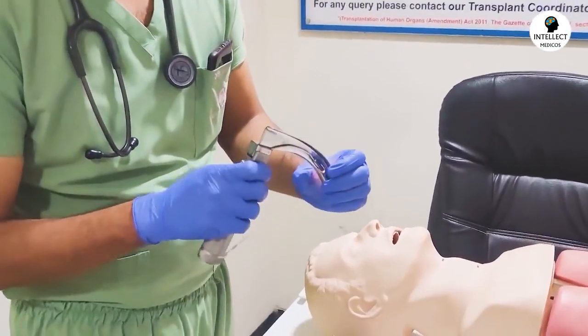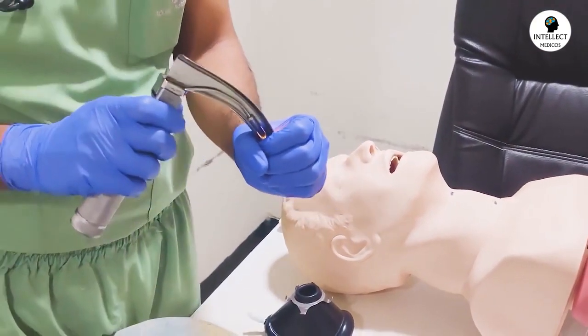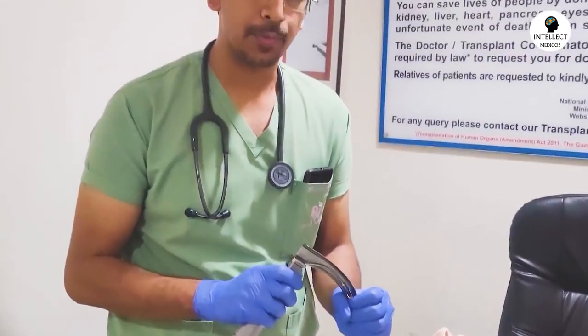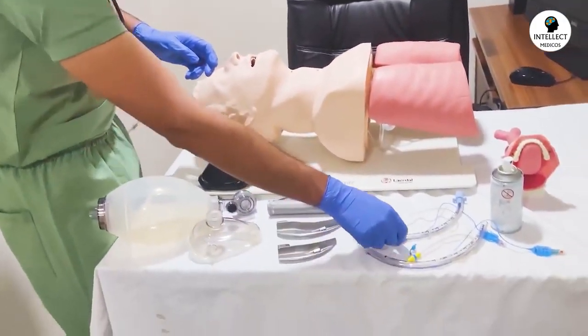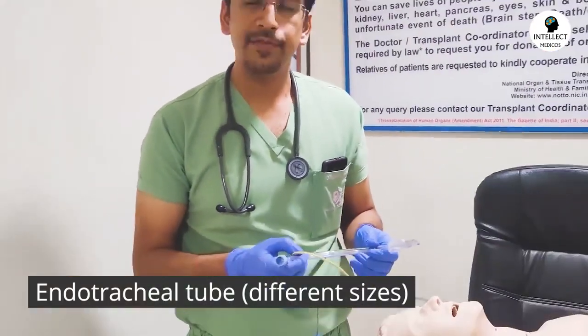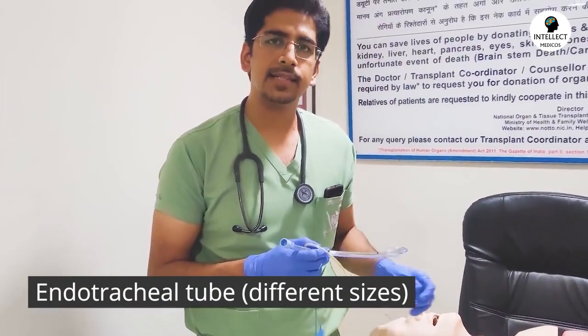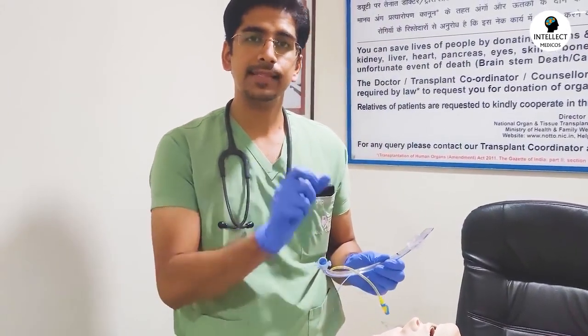Now if you are able to see the creases of your hand with this light, that means this is appropriate. The light is appropriate. Now coming on to the next thing, which is very important. This is the endotracheal tube, which we are going to insert inside the trachea of a patient. Endo means inside, and tracheal, it is going inside the trachea.